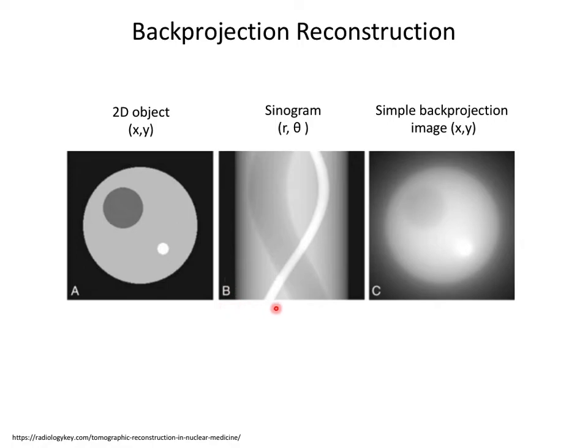When you do that, here is R in this direction, going this way. And if I stack it for different theta this way, I get a two-dimensional function that looks something like this. So here's my image, and this is called its two-dimensional sinogram, just as a function of R along your detector and different thetas. So you can imagine that the quality of the image is determined by the quality of this sinogram. How big the steps between theta are would give you kind of step functions sampling this thing.